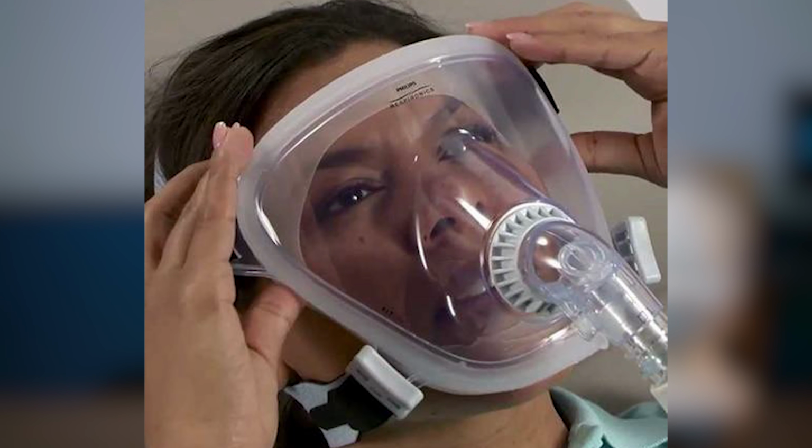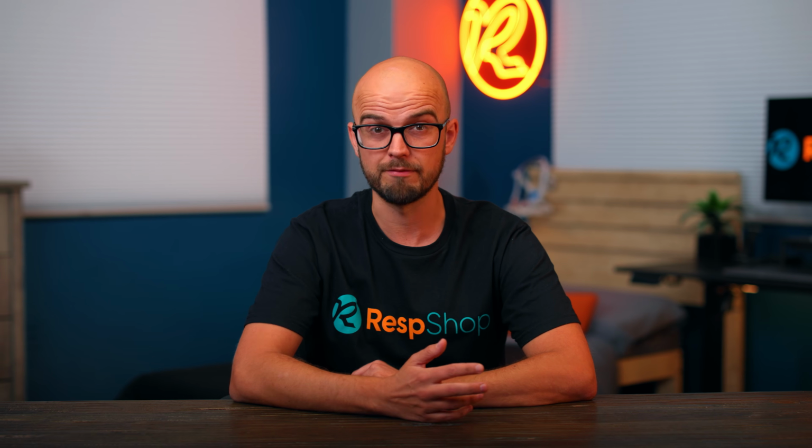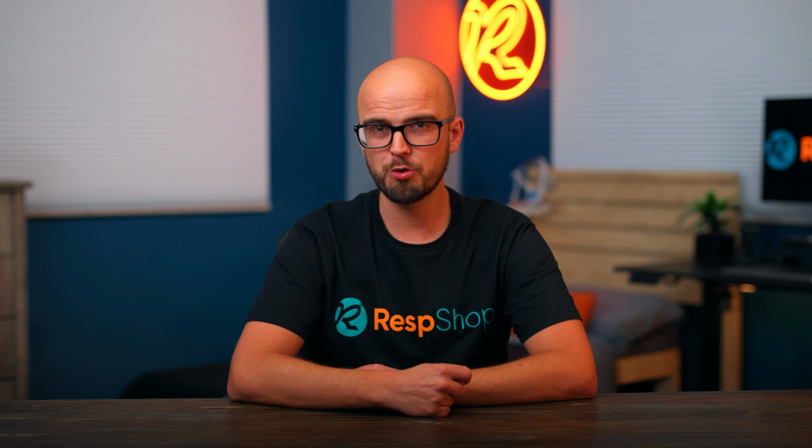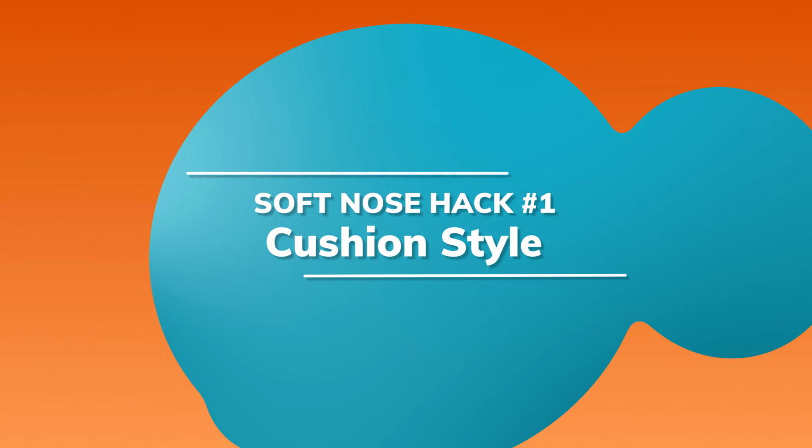It's a doozy. Having talked about high bridge noses, what about noses that are soft and flexible? The problem here is more about getting a good seal, as high air pressure can flatten the nose further and break the seal. Hack 1. Check your cushion style and size.